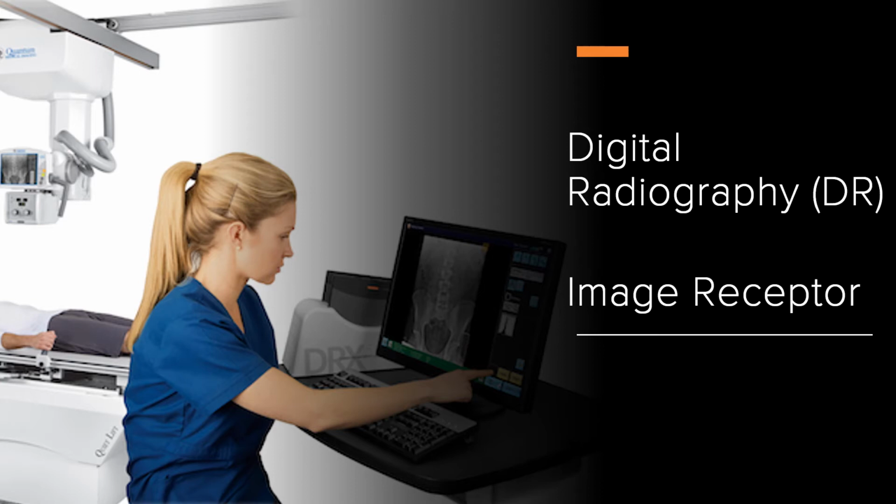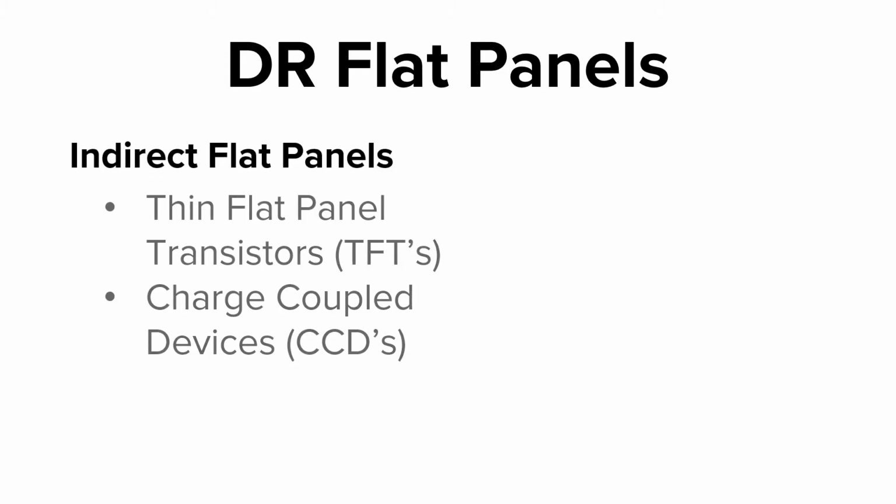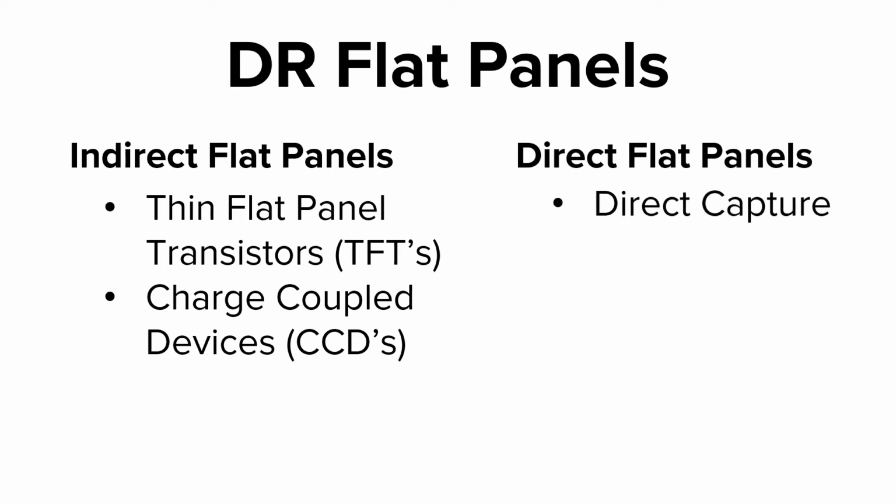Digital radiography is one of three methods used by radiographers to acquire diagnostic medical images. In digital radiography, we use one of three different types of flat panels. Those different panels get subdivided into one of two categories. The first are indirect flat panels, and the second is a direct flat panel. The major difference between the two categories is the use or non-use of a scintillating layer.